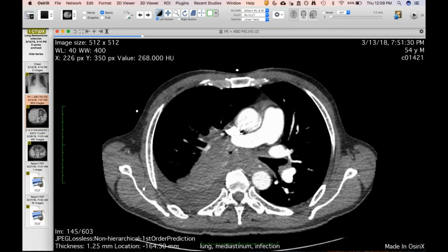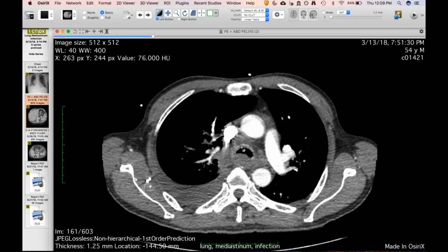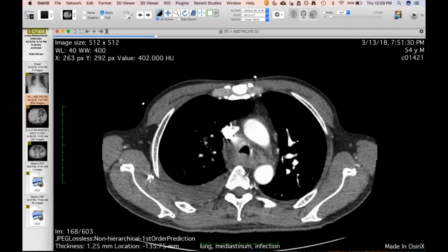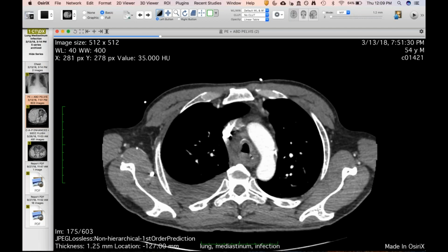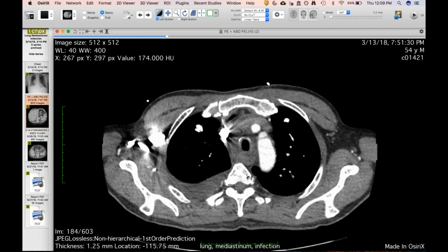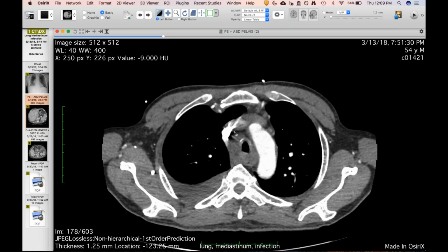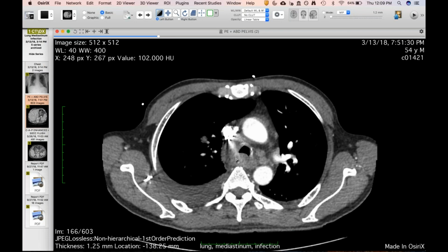And certainly things are attenuated here. There's a small effusion. I think one of the things that struck me, though, was you see here his trachea, how there's so much thickening of the wall of the trachea, because it's the cartilage. So the trachea is just really edematous, and all of this lymphadenopathy is just a conglomerate. It's not really discrete lymph nodes.